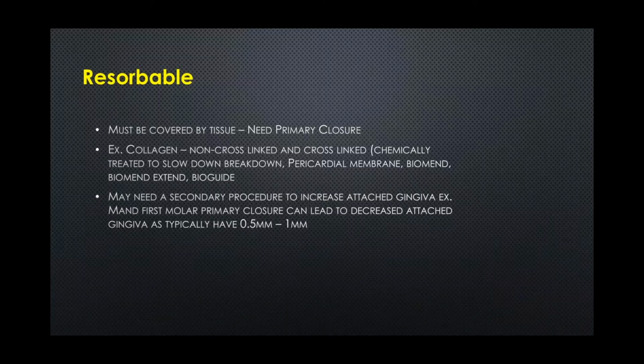Now, literature shows us that whenever we're doing dental implants, we need a minimum of 2 millimeters of attached or keratinized tissue on the buccal. So if we do a second stage procedure, or when we're ready to place our implant, we might have to make our incision, instead of crestally across the top of the crest, we might have to cheat a little bit way lingual, which could jeopardize the chance of maybe getting into a lingual nerve or so. Or what we do is we need a secondary soft tissue grafting procedure.